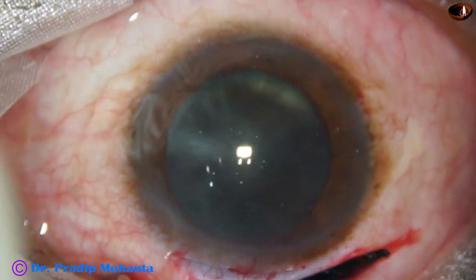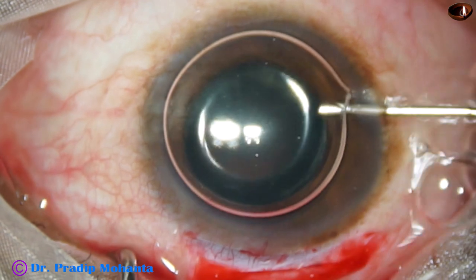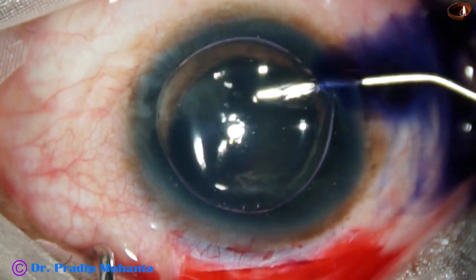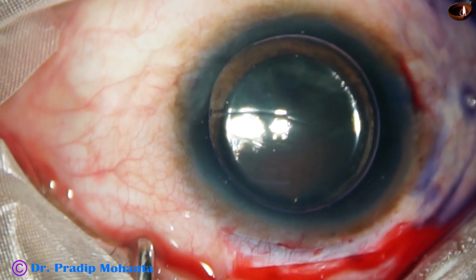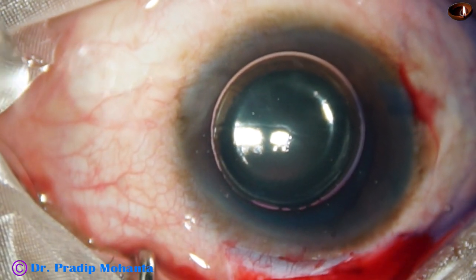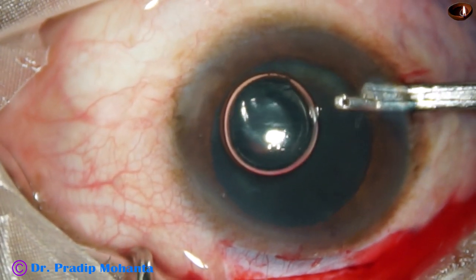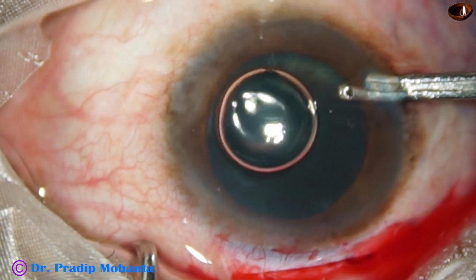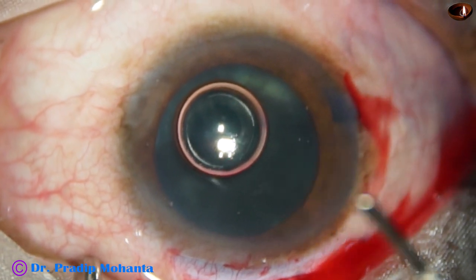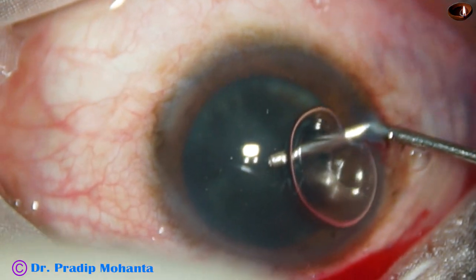Now this is paracentesis at 9 o'clock. An air bubble is injected, and trypan blue dye is applied onto the anterior capsule of the cataract. The dye should touch all parts of the anterior capsule for uniform staining. The dye is then washed out with BSS or Ringer's lactate. Viscoelastic — 2% HPMC — is then used to fill the anterior chamber.